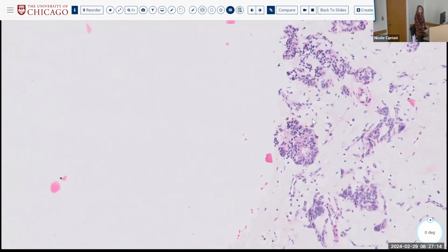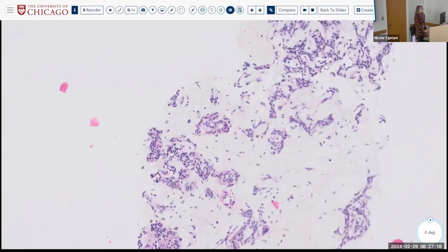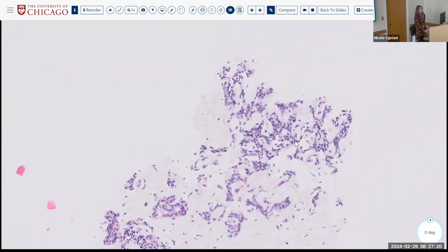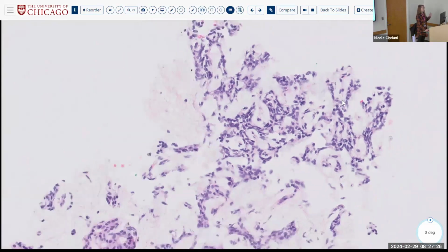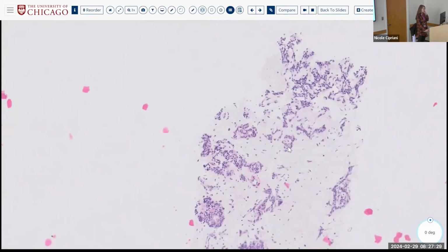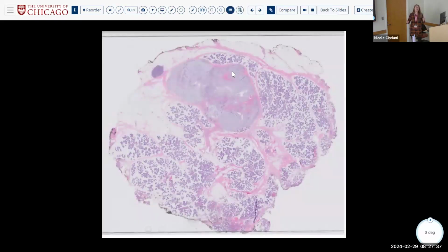Based on what I just said, yeah, low-grade salivary neoplasm, right? If you had no other information, low-grade salivary neoplasm, right? It looks salivary in morphology, you don't see anything high grade, they will resect it. If you wanna go further and prove that this is biphasic, you can prove epithelial and myoepithelial cells, and you can prove that it's a low-grade biphasic salivary neoplasm. But you don't have to.